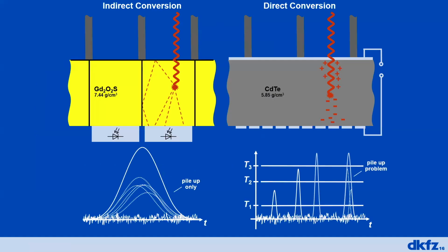Another topic we are heavily invested in right now is, of course, photon-counting CT. I guess you are all aware of how that works, but let me summarize it real quick. In case of conventional X-ray or CT detectors, an X-ray photon is absorbed in a scintillator. This results in the emission of optical photons, and these optical photons are guided towards photodiodes where the electrical signal is eventually formed.